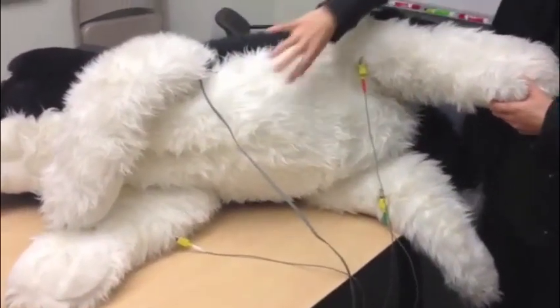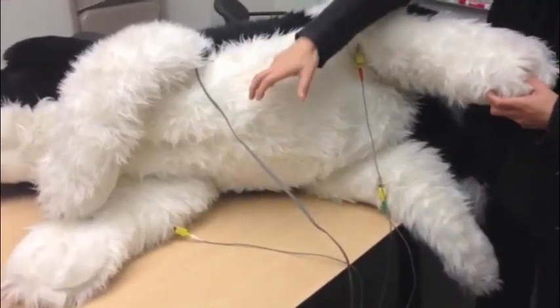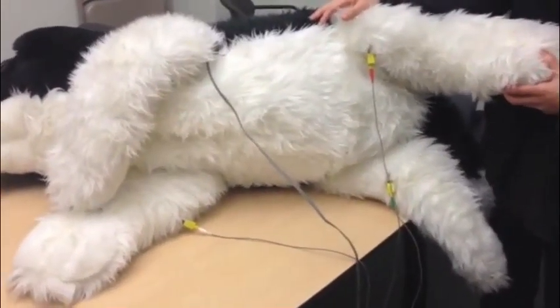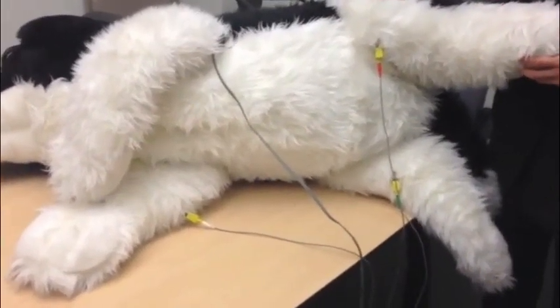And it basically helps you measure and determine the mean electrical axis, the electrical current of your heart. And there are other things that you can figure out with the leads, like the AVR, the AVL, and the AVF. But if you want more information, there is a great diagram in Duke's that will explain that all to you. Thanks.